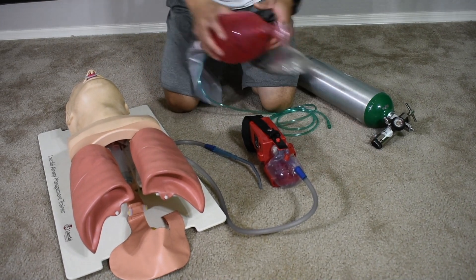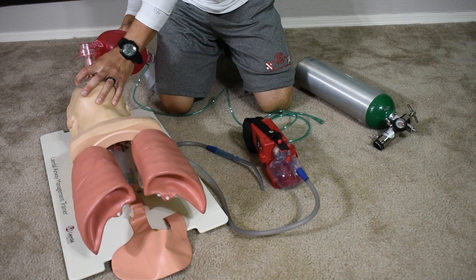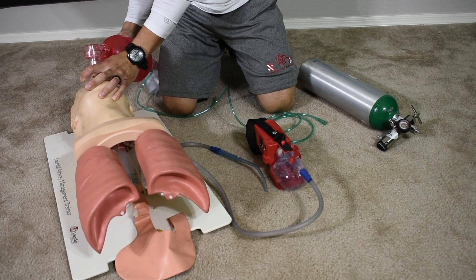I'm going to ventilate with BVM at one breath every five to six seconds, at a rate of 10 to 12 breaths per minute.